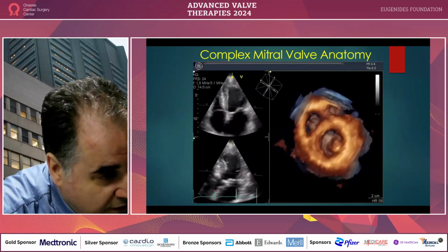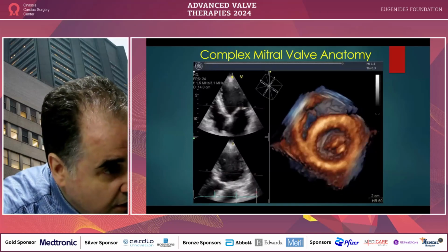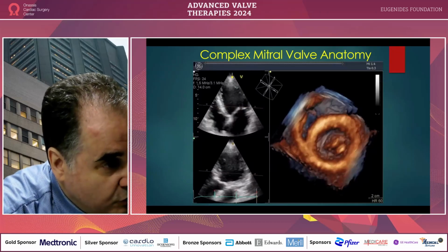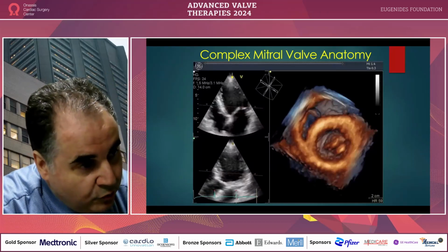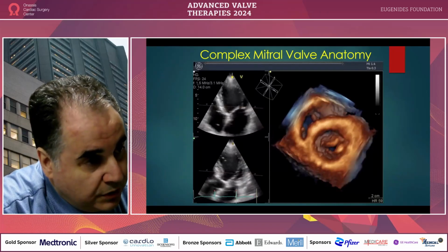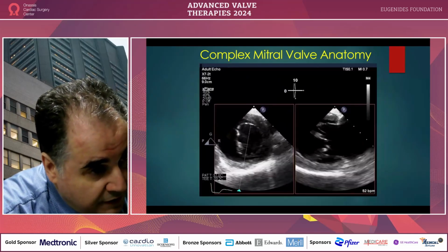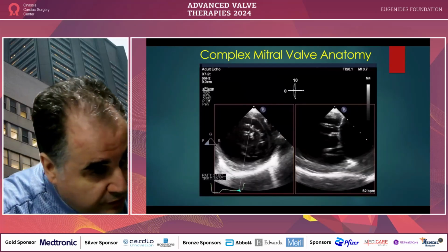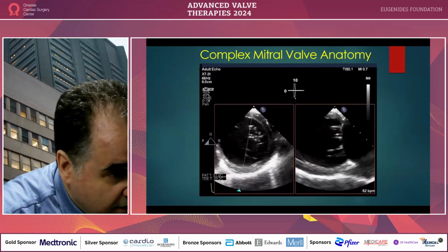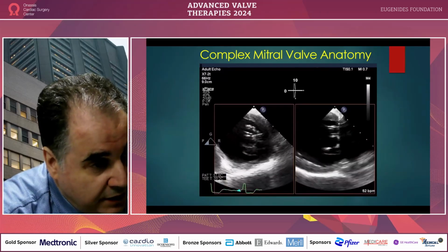After a lot of effort, and Dr. Ninios brought me memories of the Cardiovalve, we're still trying to find a valve that can solve the problem as we did for the aortic valve. The images show why it's so difficult and different from the aortic valve. There are many structures to deal with: the papillary muscle, the chordae, the leaflets, and that makes finding the best procedure very difficult.